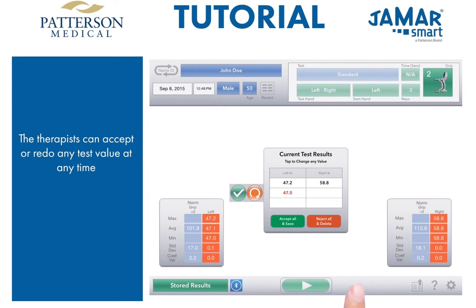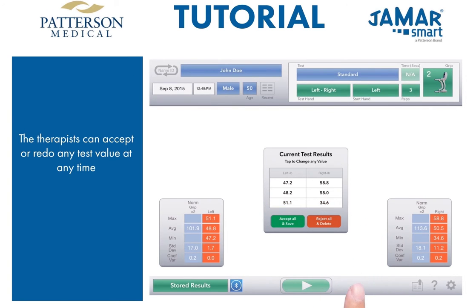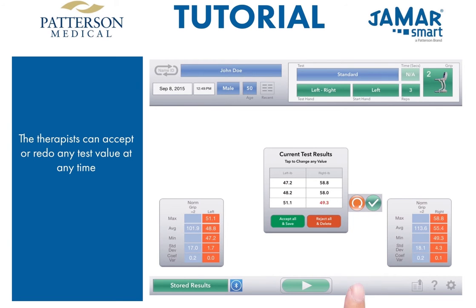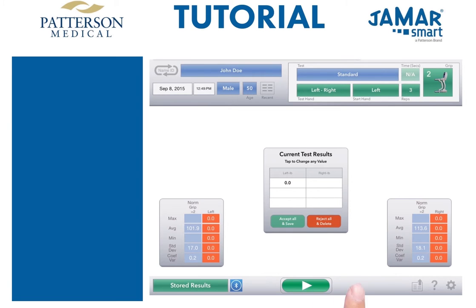You have the option to accept or redo any test at any time. Just tap the redo button and that value will reset to zero, allowing the test to be performed again. Once you are happy with the value, tap the check button to accept. After completing all three reps, if one value is not consistent with the others, simply tap that field to redo that trial. The tables show the statistics for this test and how that compares with the norms for this age and gender. Once we are happy with the results, all data can be stored for retrieval later by tapping 'accept all and save.'